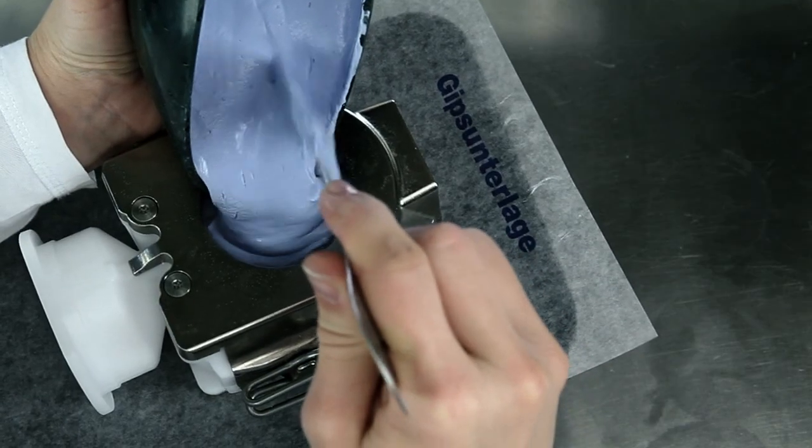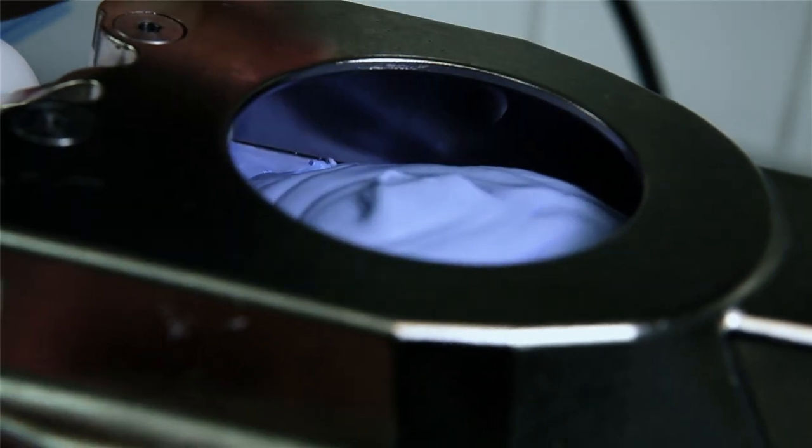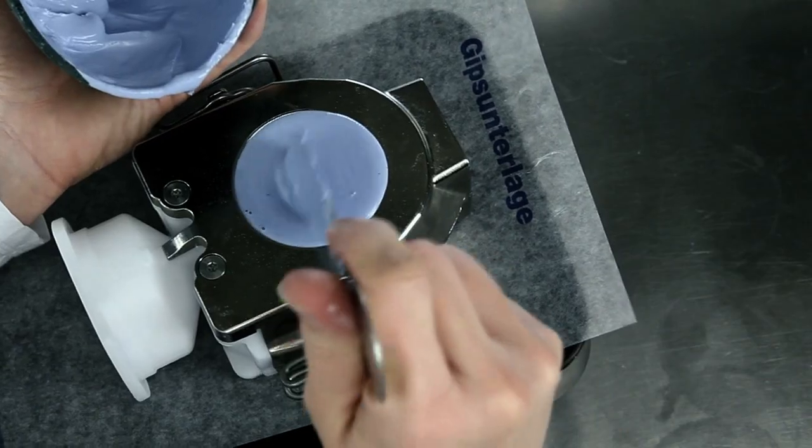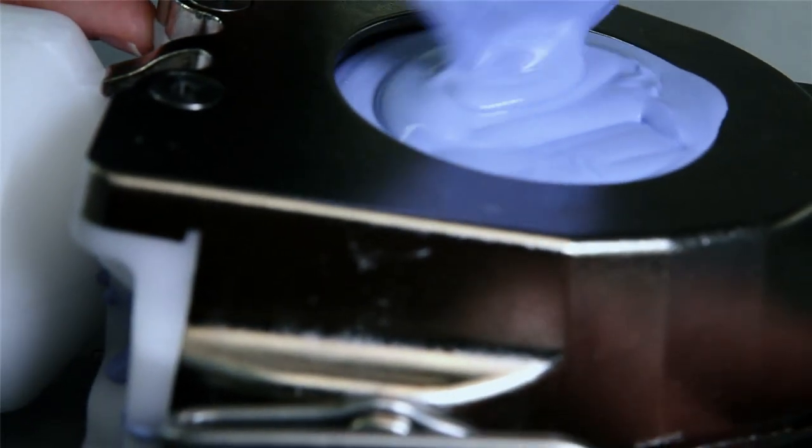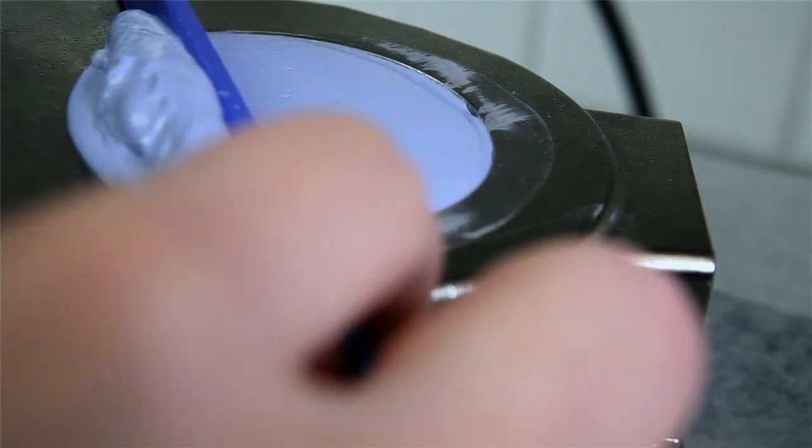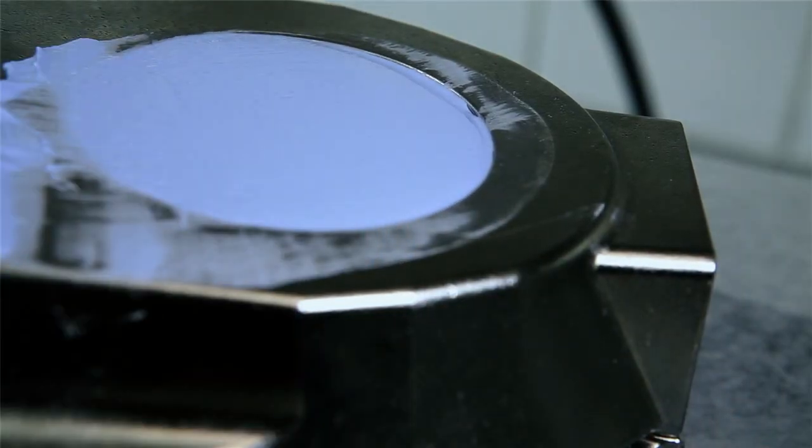Allow the mixed class 3 stone to flow into the opening of the flask on a shaker until the flask is completely filled. Prevent air from being trapped in the material. Skim off the excess stone using the IvoBase spatula so that no stone protrudes from the flask opening.